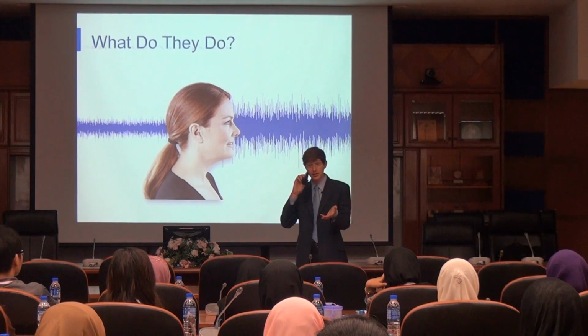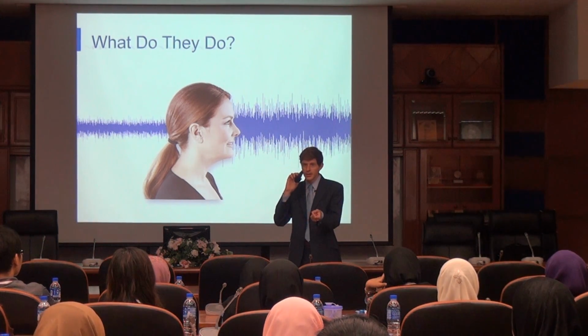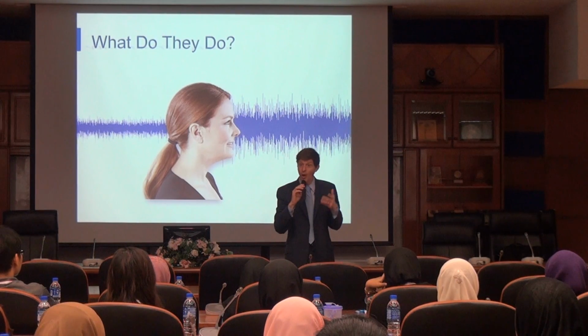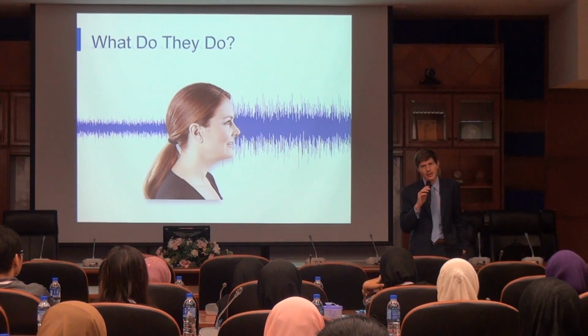Is that surprising? Because I'm so close, you should still hear me, right? But you can't. You just hear my natural voice without the amplification. But when I turn it around like this again, all of a sudden you hear me. Isn't that interesting? So why does that happen in a microphone like this?